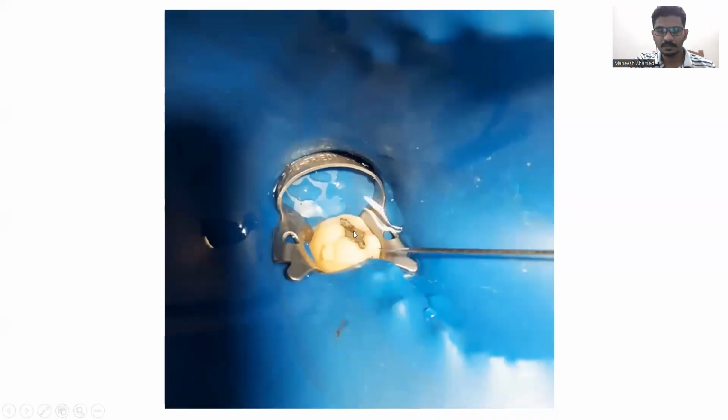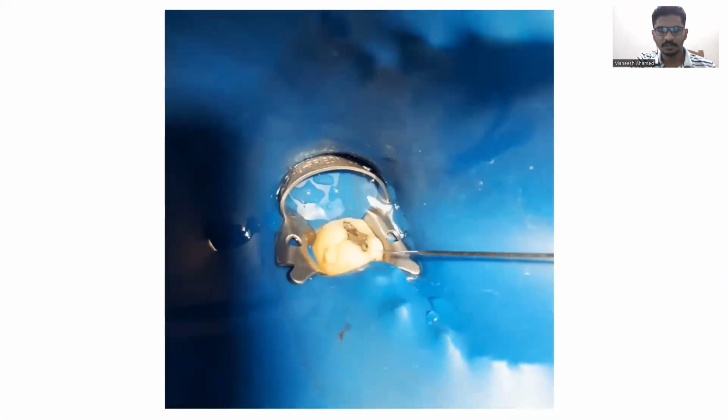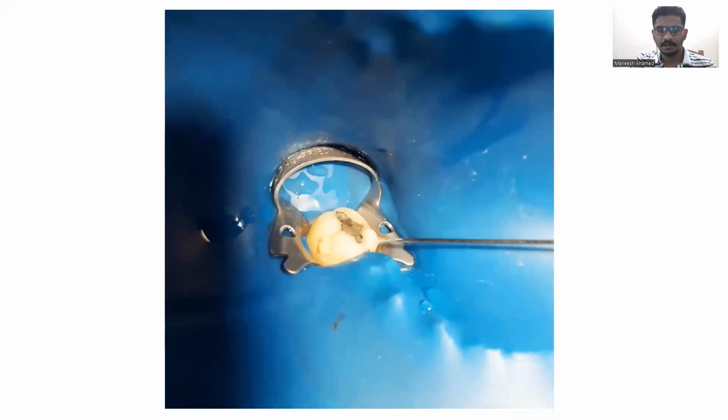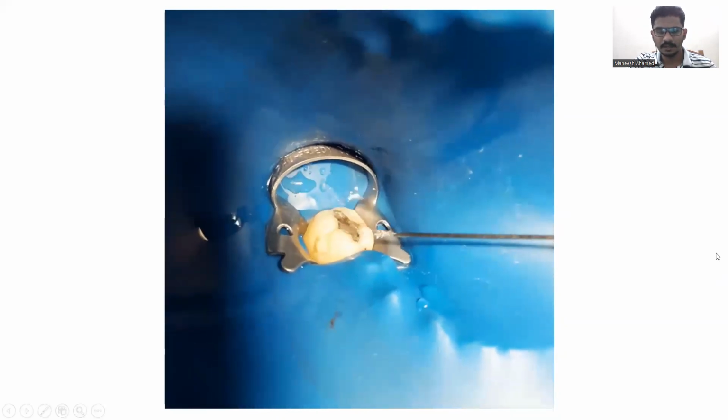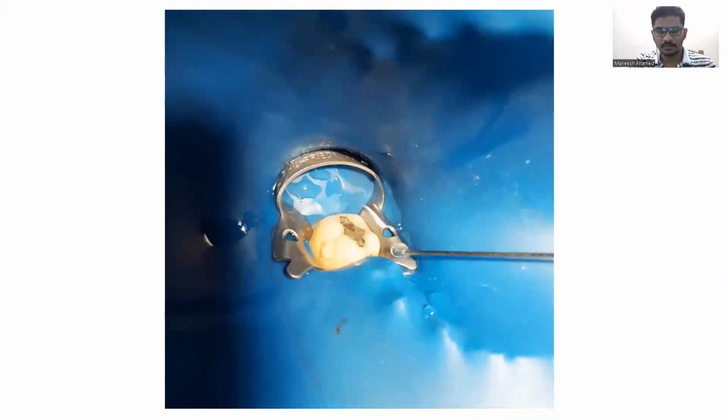So this diagram shows how the cold water is used to test the vitality of the pulp. The tooth is isolated properly by using rubber dam, and the cold water is applied directly on the tooth in order to elicit a response.